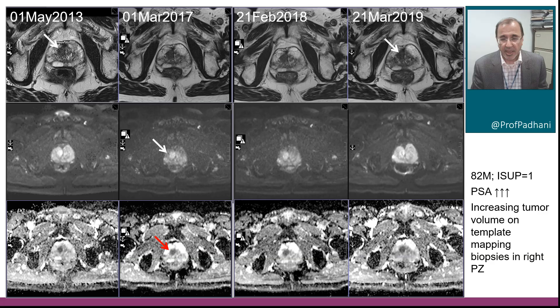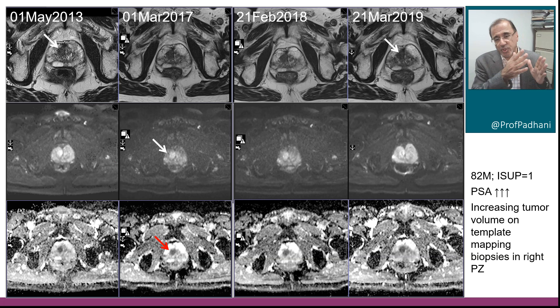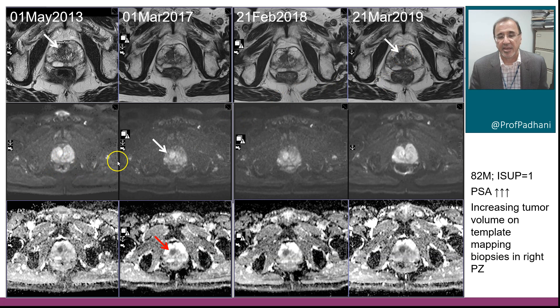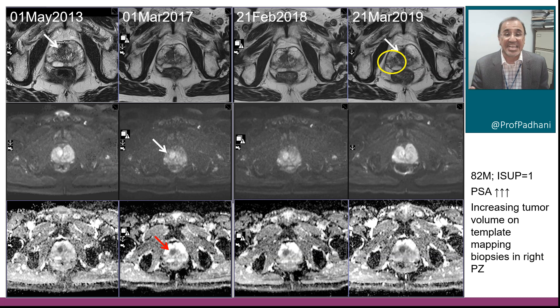That's what we did with this particular patient. Over five years, the central stromal nodule in the transition zone did not change. But the right peripheral zone lesion did change. When the patient underwent template biopsy in 2019, we found an increasing volume of tumor coinciding with a rising PSA level.